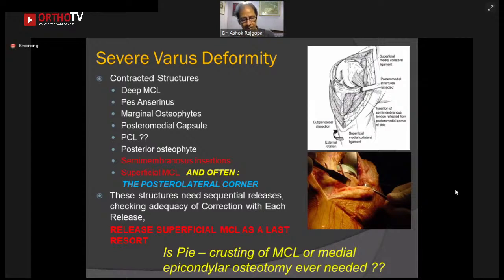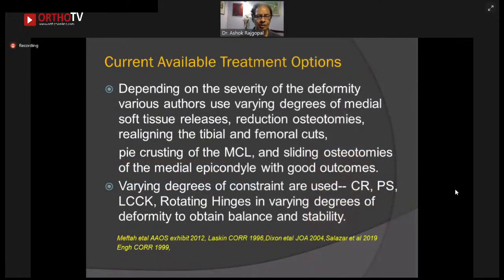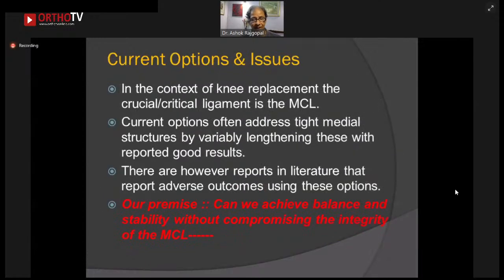So our question was, is pie crusting of the MCL or medial epicondylar osteotomy ever required? Depending on the severity of the deformity, different people use medial releases, reduction osteotomies, they realign the tibial and the femoral cuts. You slope the cuts in a particular way, they pie crust the MCL, or do a sliding osteotomy of the medial epicondyle, and a lot of authors have reported good outcomes. When we do this, all of these authors have also described the use of a rotating hinge or LCCK to obtain stability and balance. Again, as I keep reiterating, for me the crucial, critical ligament is the MCL, and all your structures need to be balanced around it.